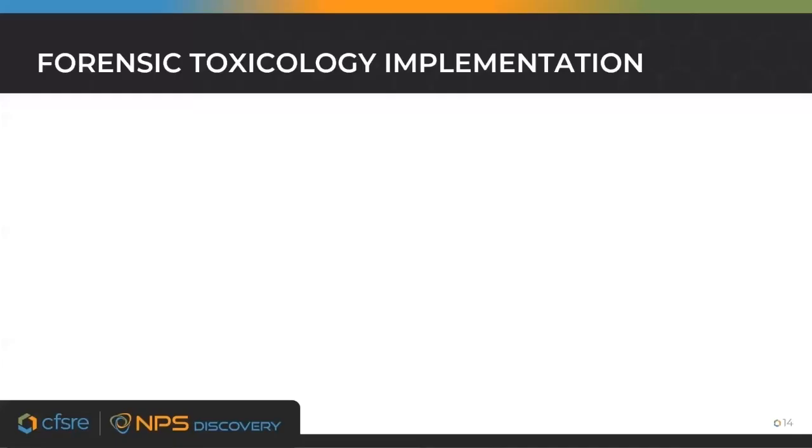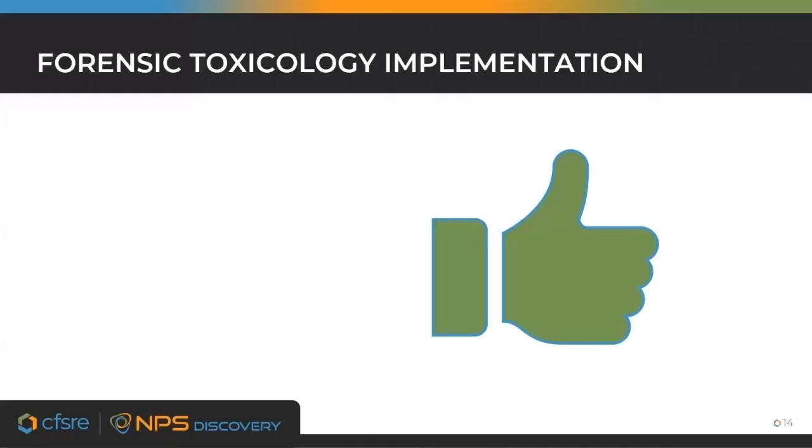Some guide on implementation. How can we get a successful implementation of neutral losses and common fragments? Well, if you're attending this webinar, you're already halfway there, because implementation gets a huge leg up by using QTOF technology. You can do this with a triple quad, but the information from nominal mass is much less informative than what you get from a high resolution tandem mass spec system.